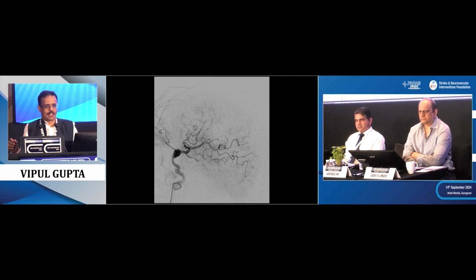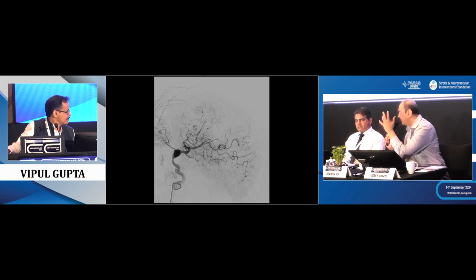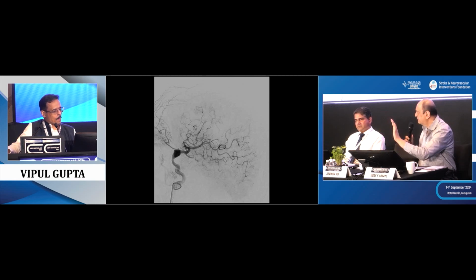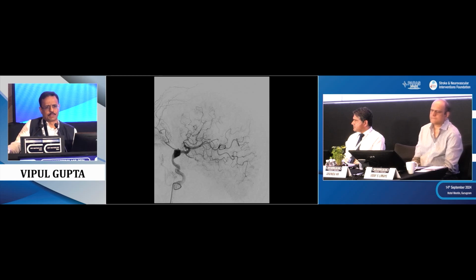Now we have embolism in hand. Now what to do? Just put heparin. Microcatheter is right there. So be very aggressive here. So we took the microcatheter and we injected some injectable antiplatelet agents. Usually that works very well in our experience. This is acute platelet clot.